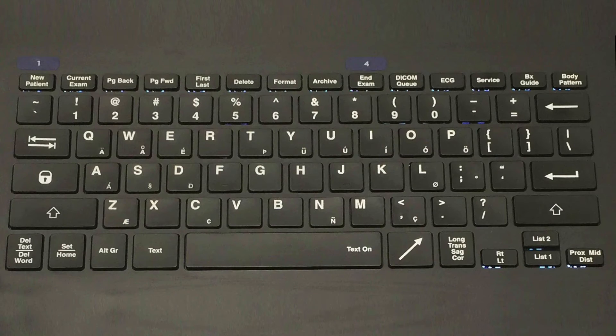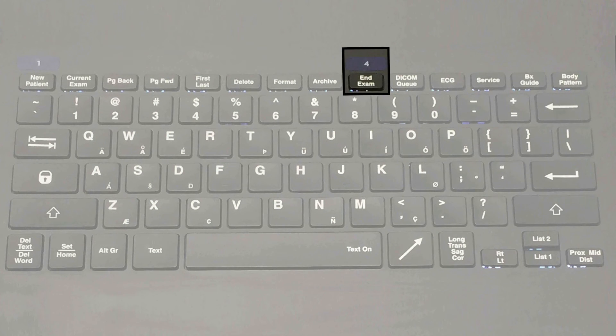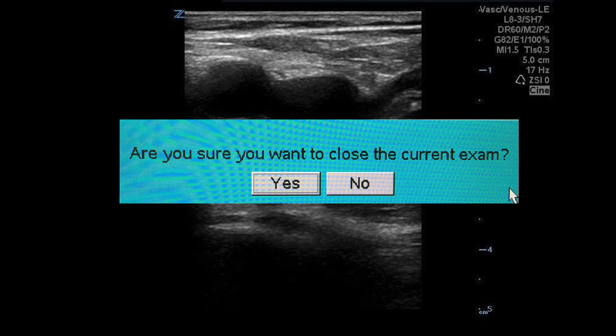Once you are done with the system, press the number four key or end exam. This will end the exam and complete sending the rest of the information to QPATH. It will ask: are you sure you want to close the current exam?